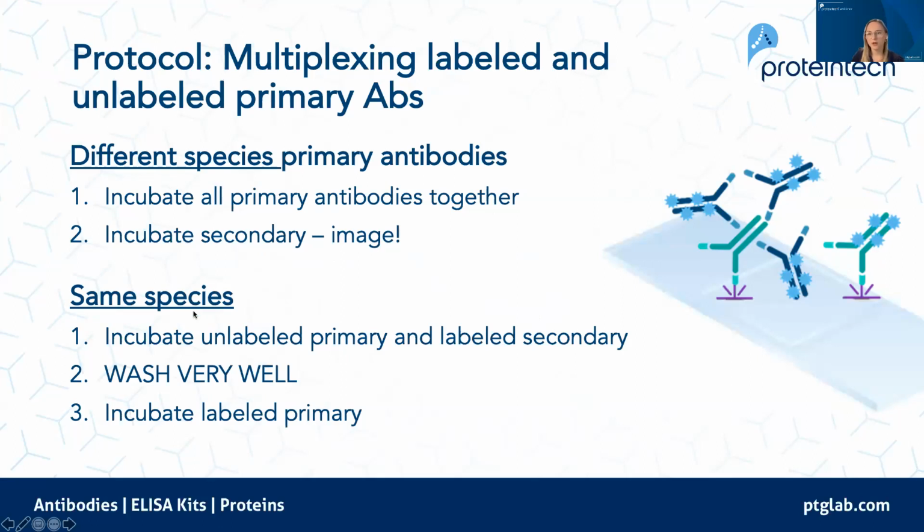However, if your primary antibodies, the labeled and the unlabeled, are of the same species, then first what you want to do is run your unlabeled primary and secondary as normal and wash very, very well. So you want to remove any of that secondary antibody that might be binding to your other primary. So you want to remove that, wash really well, and then you can simply incubate with your labeled primary and then you're ready to go. So it's obviously a slightly longer protocol, but it still gives you the results that you need, the really beautiful labeling.